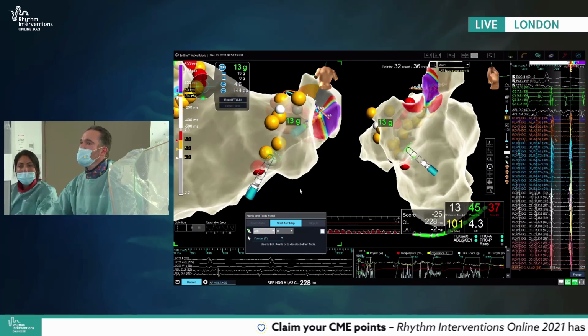Ross, can you summarize the results of your STAR trial, or the results you're getting using this mapping strategy you're using in this case? You obviously are using it because you think it makes a difference, but can you summarize the data that supports it, or is it just your impression?